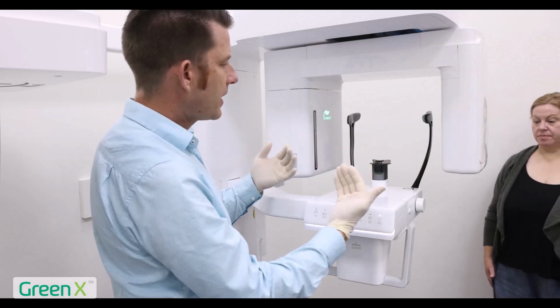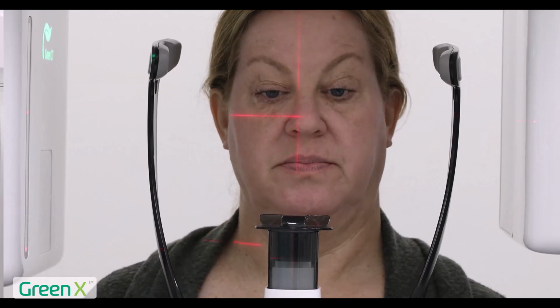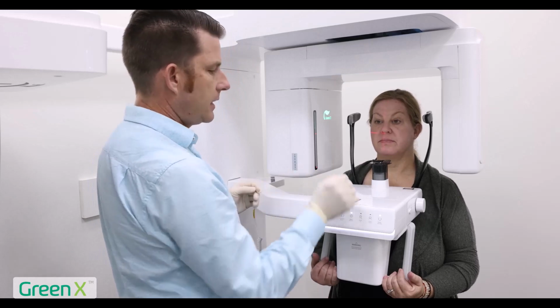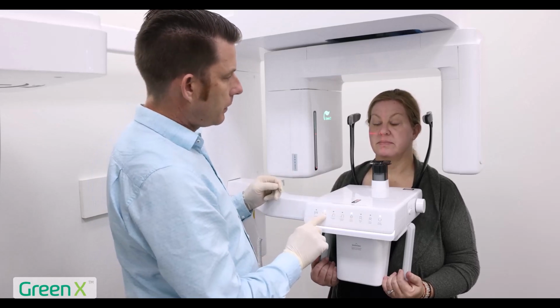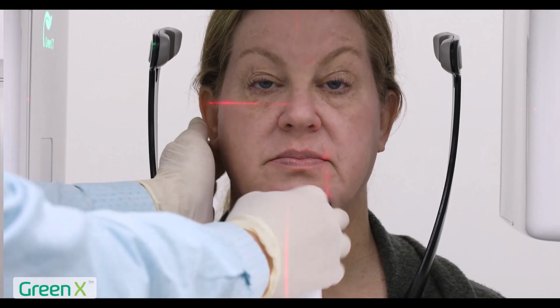I'm going to bring my patient back into the device. Go back through our patient positioning protocol with the hands, palms facing up, feet shoulder length apart. And in this case, I'm going to raise the column up a little bit and just rest your chin and move back right in that groove there.